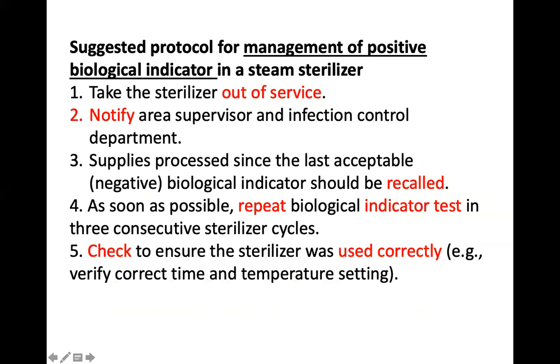Yes. Okay, so this is a suggested protocol for management of positive biological indicator, okay? Within the hospital setup. In a hospital, and in a big hospital, by the way, this is an entire department, part of the infection control department, the department that deals now with sterilization and would have the autoclave, etc. Okay, so when you get this positive biological indicator, one, immediately take the sterilizer out of service. Like you cannot process any other item from that point where you have a positive biological indicator.